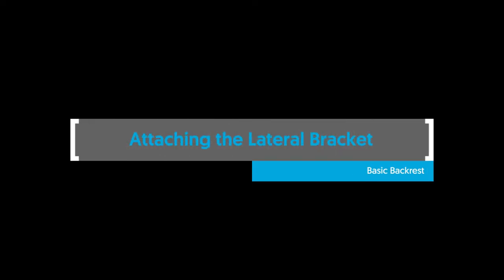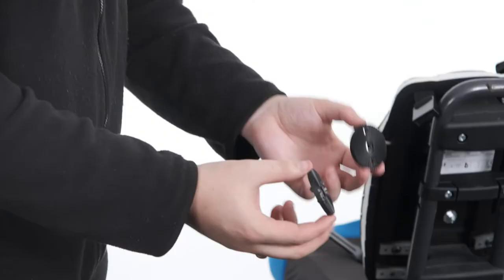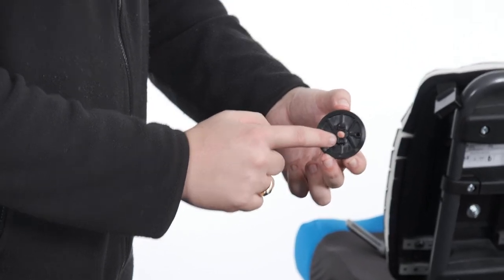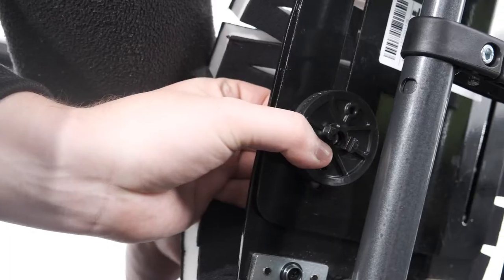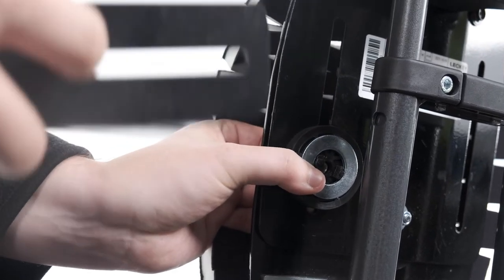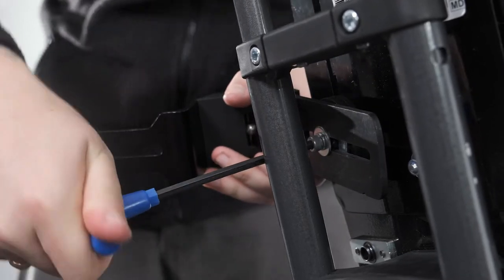Attaching the lateral bracket — basic backrest. To attach the lateral bracket to the basic backrest, place the T-nut into the vertical slot from the front side of the backrest platework. Mesh the two sides of the radial clamps together and locate the protrusion into the slot in the bracket. Locate the opposite protrusion of the radial clamp into the slot of the backrest, ensuring the radial clamp sits flush with the surface of the platework. Ensure the T-nut nests between the two surfaces of the radial clamp at the front of the backrest. Place the split washer then the plane washer onto the bolt and pass it through the hole in the radial clamp, engaging the threads of the T-nut. Secure in place with the Allen key.